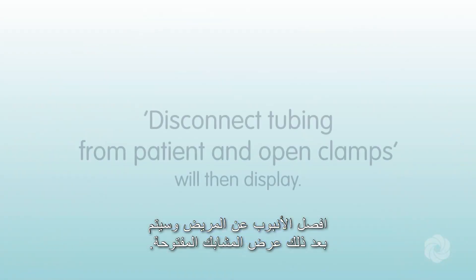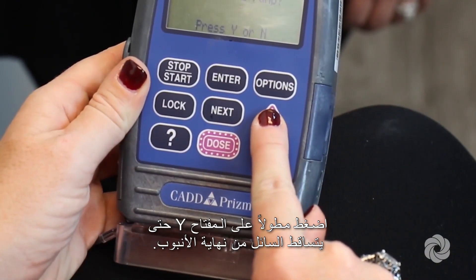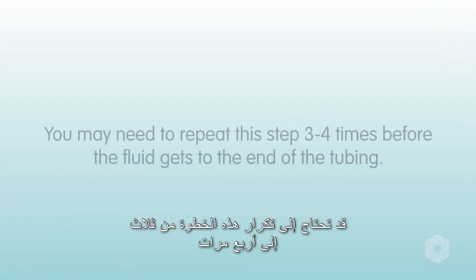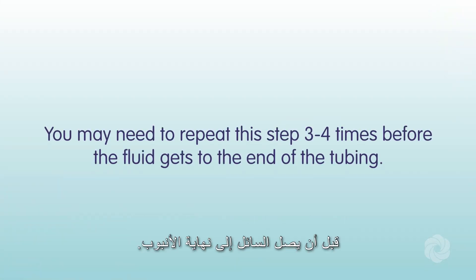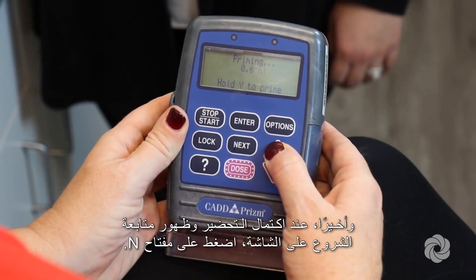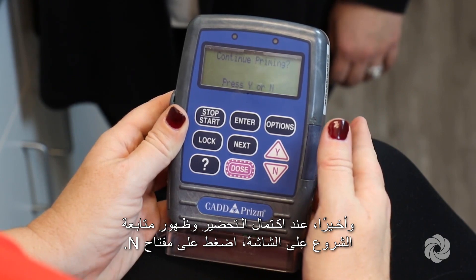"Disconnect tubing from patient and open clamps" will then display. Press and hold the Y key until fluid drips from the end of the tubing. You may need to repeat this step three to four times before the fluid reaches the end of the tubing. When priming is complete and "continue priming" appears on the screen, press the N key.